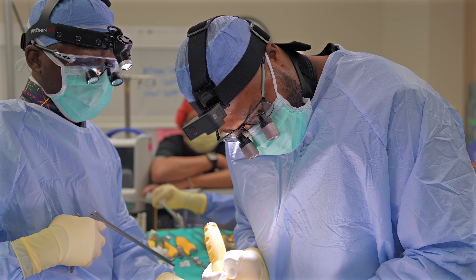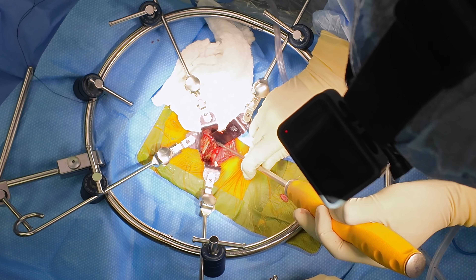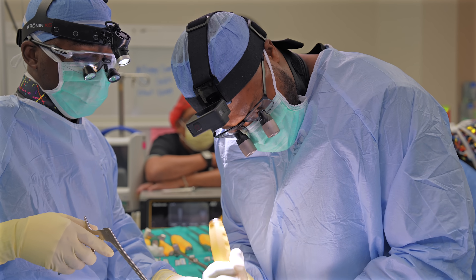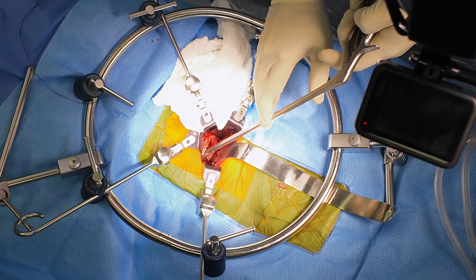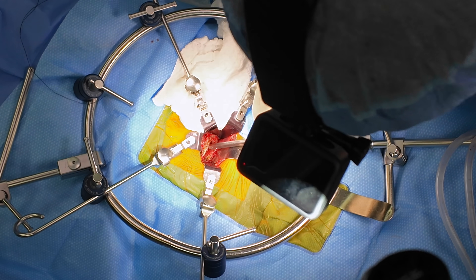Right now we're just preparing the end plates — cleaning her end plates, taking all this disc off that's worn out. She has a large herniation on the left side of her spine that's compressing her nerve. This is a pretty severe collapse here. This is L5, this is the S1 vertebral body, and we're trying to open it up — it just keeps closing back down here.